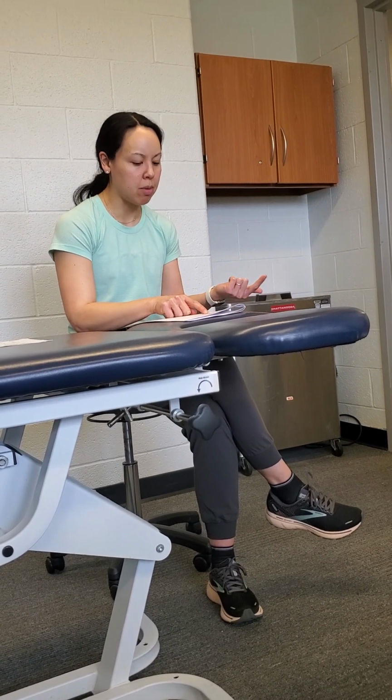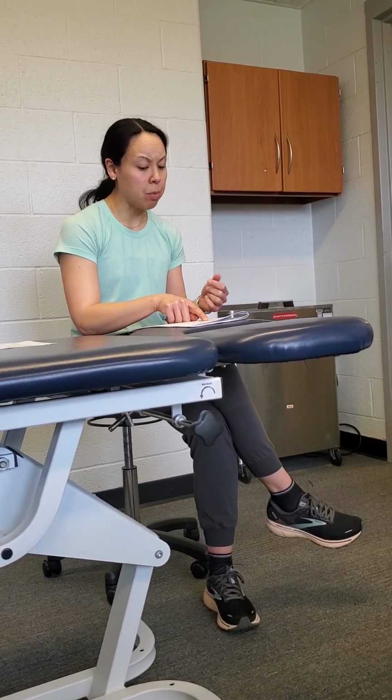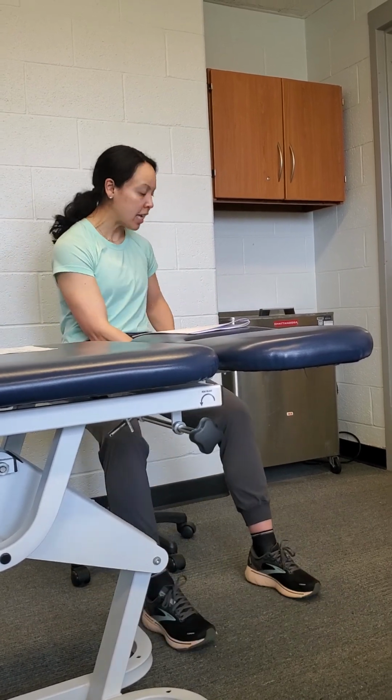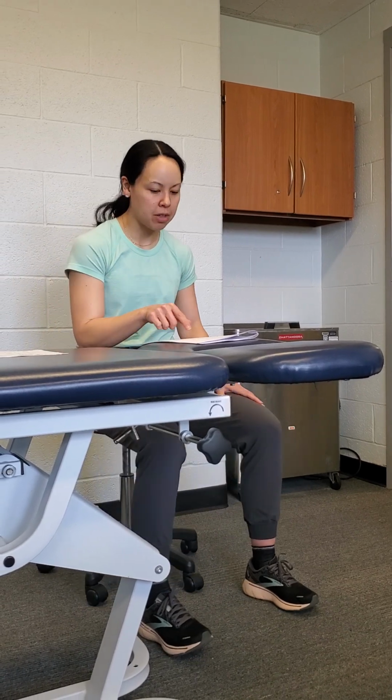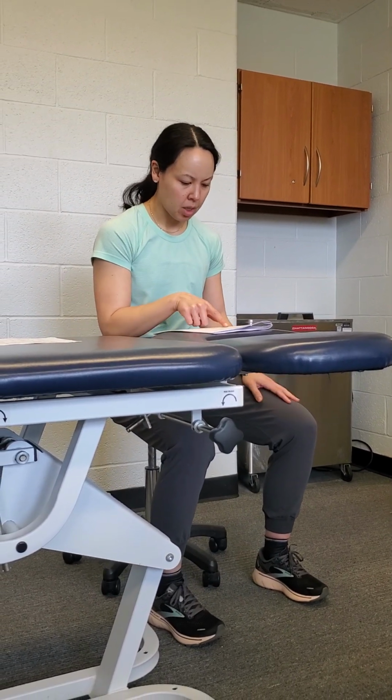Another question that came up during the course is whether it is safe to put the e-stim pads under the BFR cuff. So if the cuff is here and you want one of those up here, totally fine. Totally fine. Oh, that's interesting.